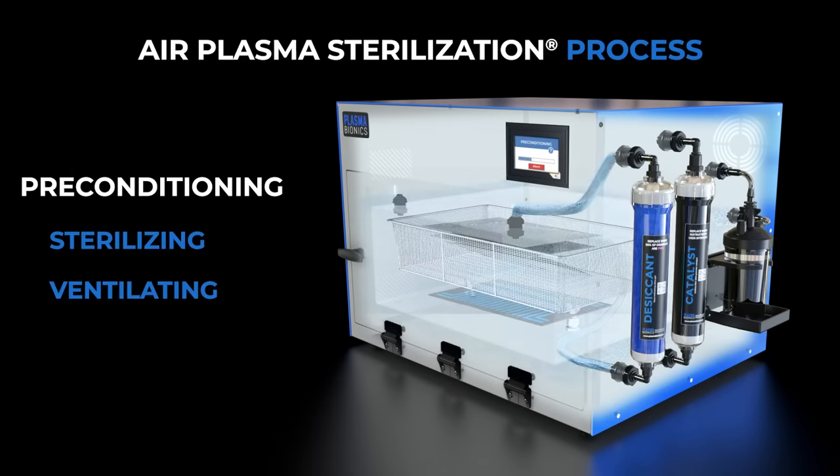During the preconditioning step, the air temperature, pressure, and humidity are optimized inside the sterilization chamber for reliable and repeatable performance.